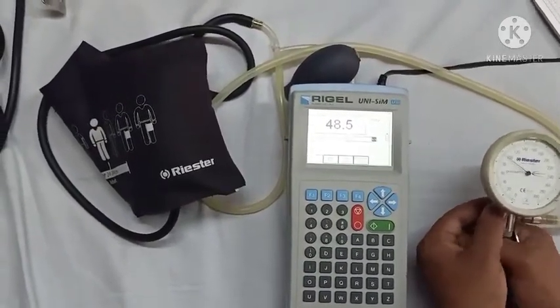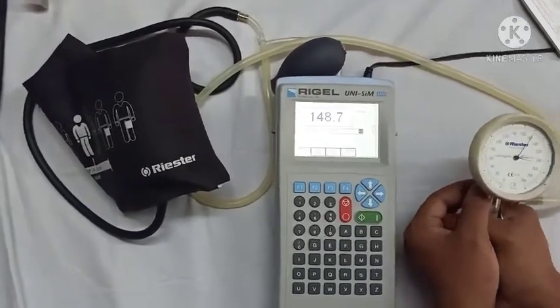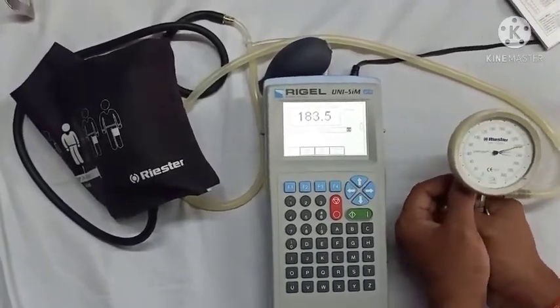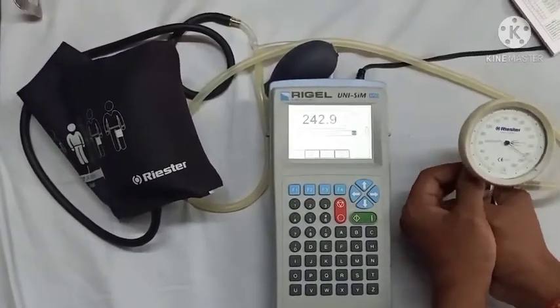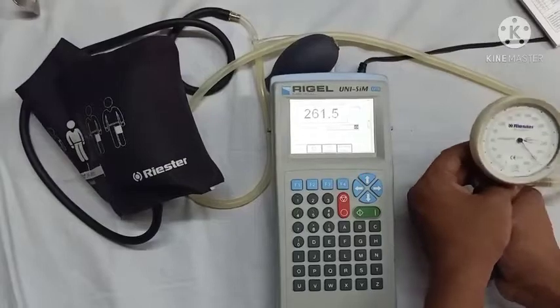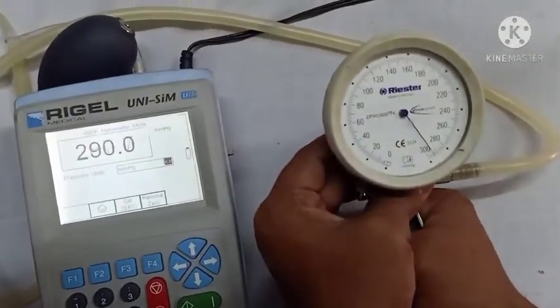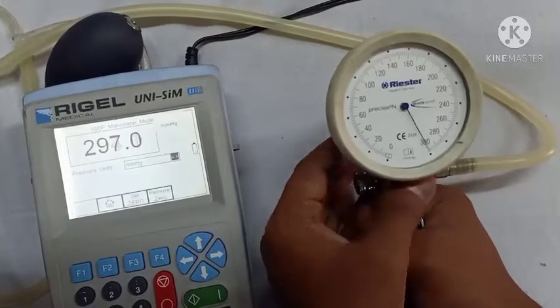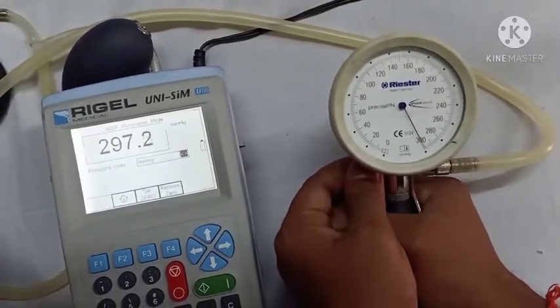Now we will start taking readings at pre-decided calibration points in increasing and decreasing order. We start giving pressure using the inflation valve up to the first calibration point, write down the reading, then continue raising the pressure up to the last point, recording the reading at each calibration point.